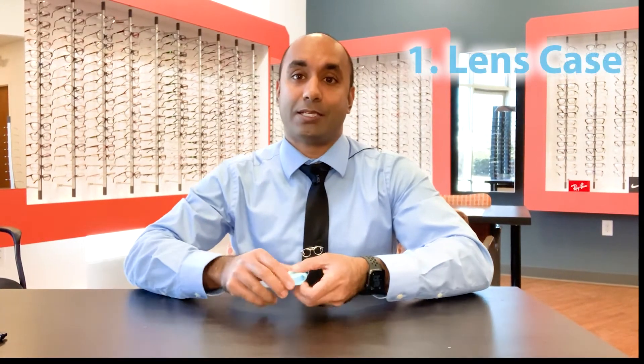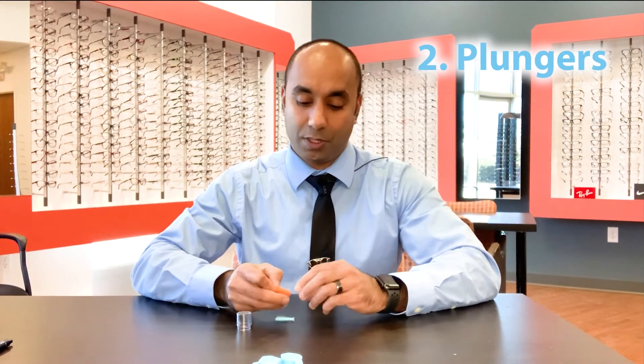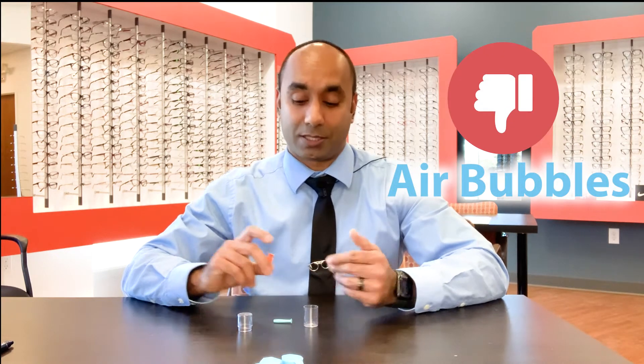The first thing you're going to want is a case — a simple case that stores the sclerals in. You're also going to need plungers. There are two types. The first is the insertion plunger, which is a little bit bigger, such as this. We like to cut the bottom off, because that prevents suction on the lens. When you're going to insert the lens, if you have any kind of suction, it makes it harder to get on and more likely that you're going to get an air bubble. Air bubbles are very bad when you're wearing a scleral.